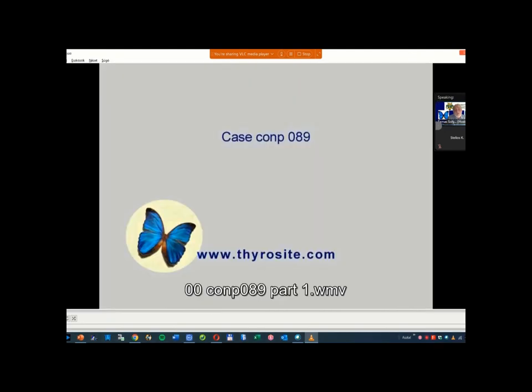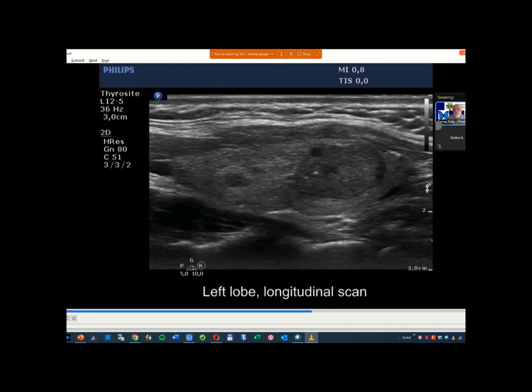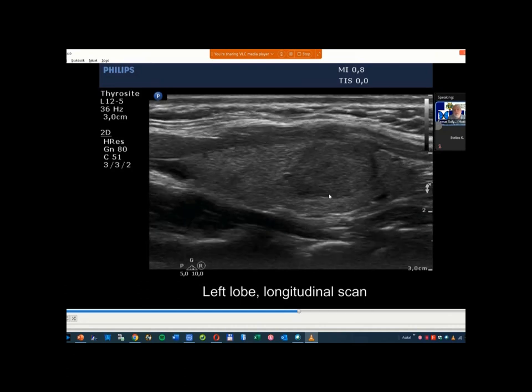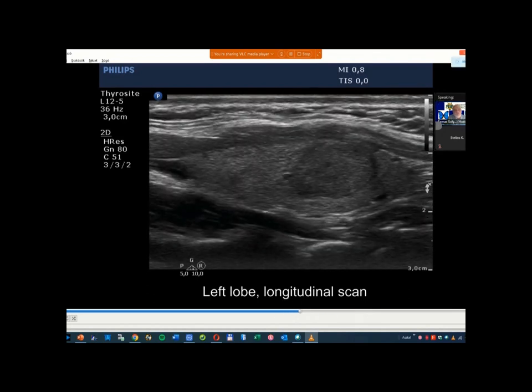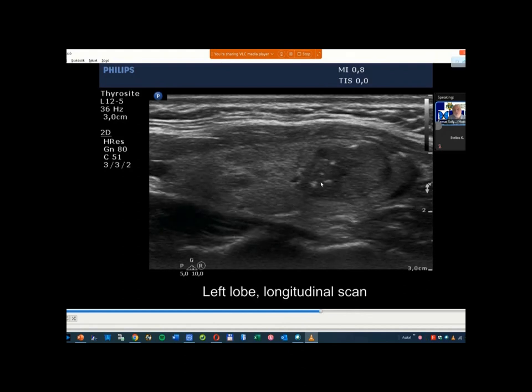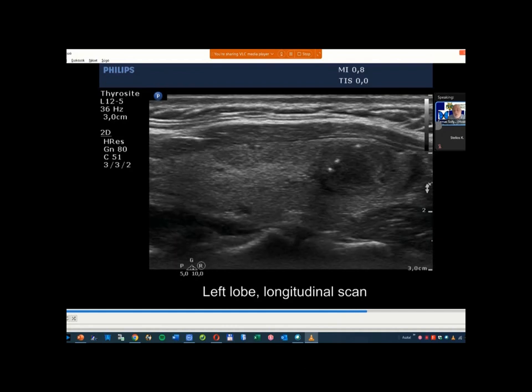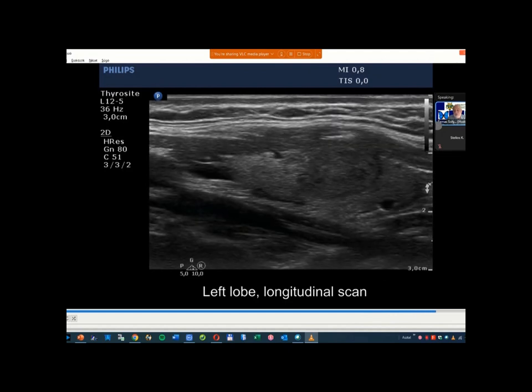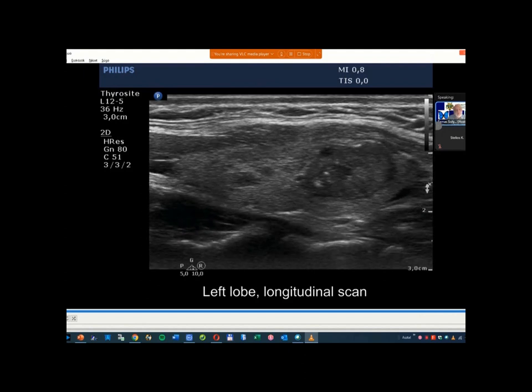I don't think that this nodule would contain back wall figures. No tiny linear forms, except for here, but maybe I was wrong. Here, that form, yes, this is a back wall figure, okay, I corrected myself. So here, this is a linear form, dorsal to a deeply hypoechoic or anechoic tiny cystic area. So coarse calcification present, back wall figure present. The issue is the interpretation of these echogenic spots, and we will deal with this problem during this lesson.